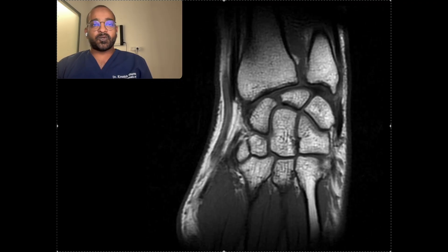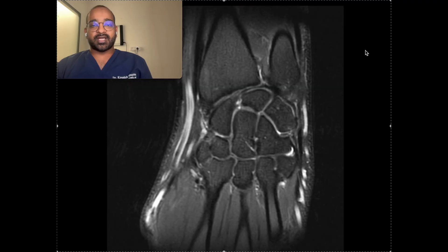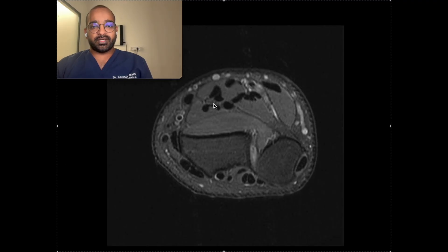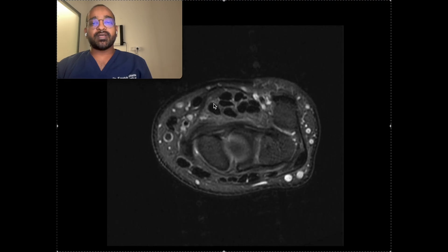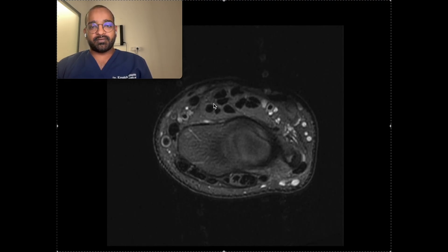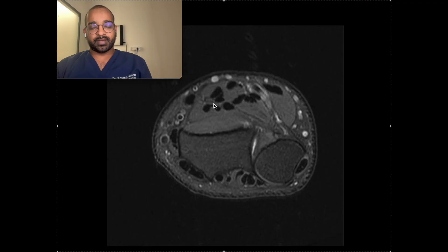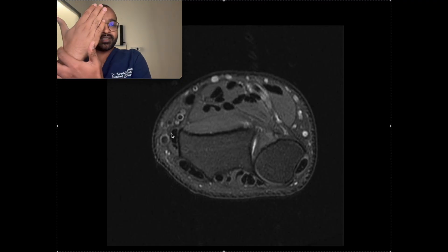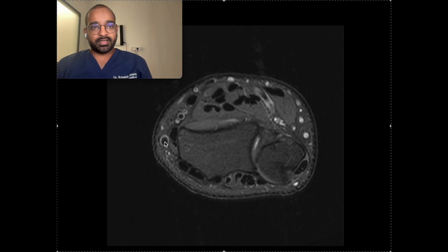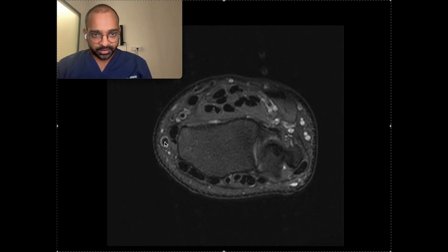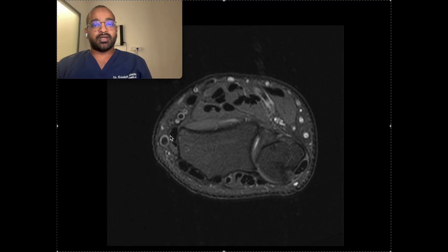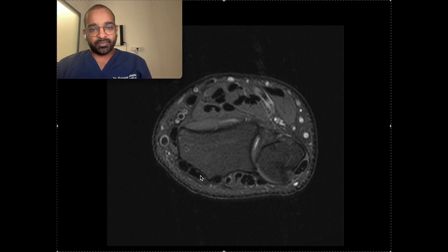Let us go to the tendons of the wrist. I want to show them on the PD fat-suppressed axial image. I'll start with the extensor compartment. The first compartment is on the radial side towards the thumb. The tendons of the first extensor compartment are abductor pollicis longus and extensor pollicis brevis.